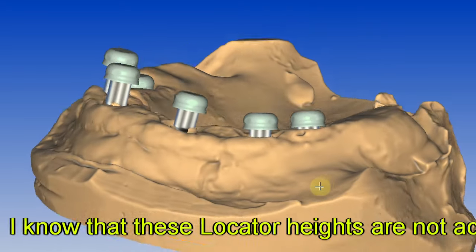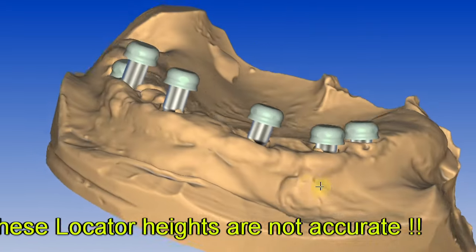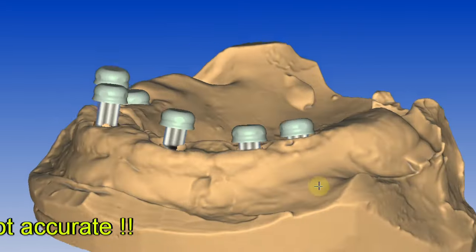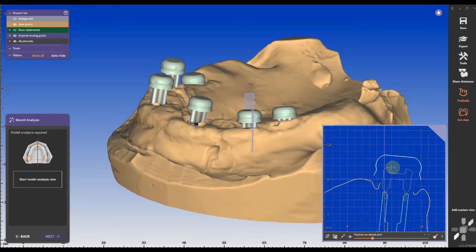The locators from Zest will ship to you while the printed and milled parts are getting assembled at the lab. That will save time and will cut your turnaround time basically in half.